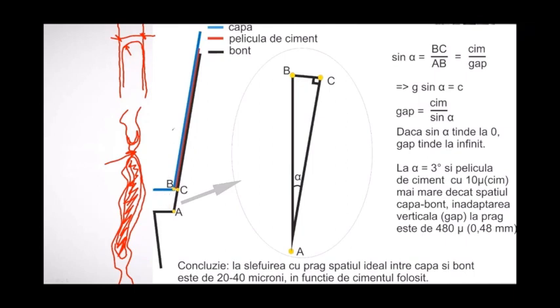That's true. But let me tell you something. It's still high. It's still high in occlusion. You still have a high spot in occlusion. So you don't solve the problem. You solve only half of the problem. But the main issue is there.